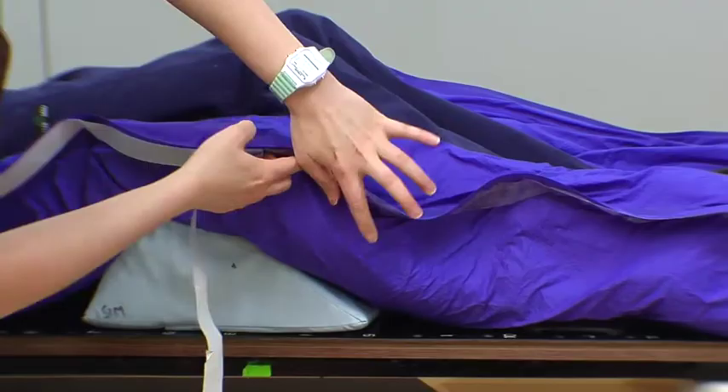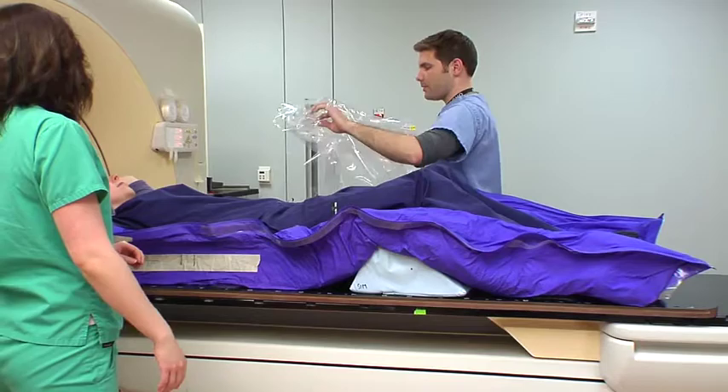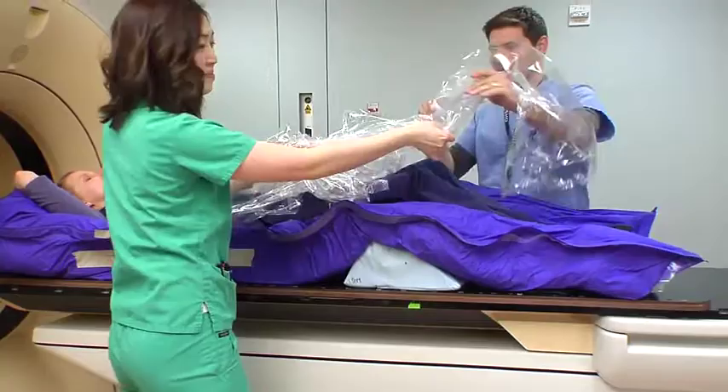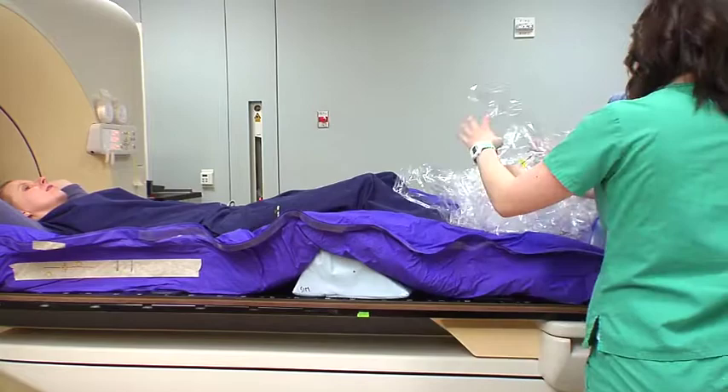We'll just pull here — just make the bag pull out. We won't cover too much of you, just your lower half. Nothing above your stomach; some of it might get on your face but we're not going to keep it there. The bottom of this is closed in. We're going to connect the bottom of it first and then we'll connect the sides later — try not to tickle your toes.